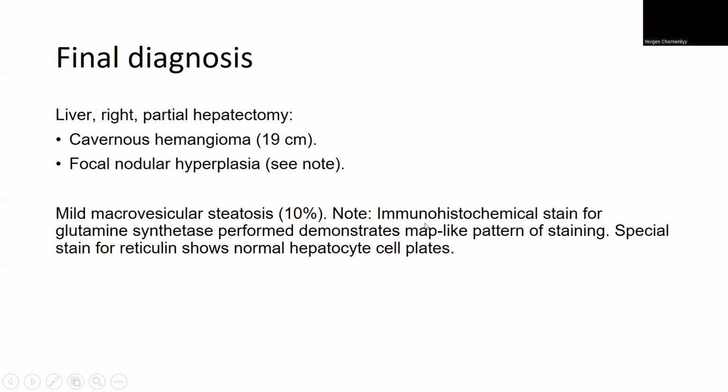So that. Vikram, would you comment on the radiological appearance of these lesions? Just because I have an anecdotal thing to say after that. Yeah, these radiologists are pretty good at making these distinctions. Not only can they see the star, but they also have these radionuclide tracers now, where they can tell between FNH and HCA, and they can tell between the various adenoma types. And so they've gotten pretty good at this business.